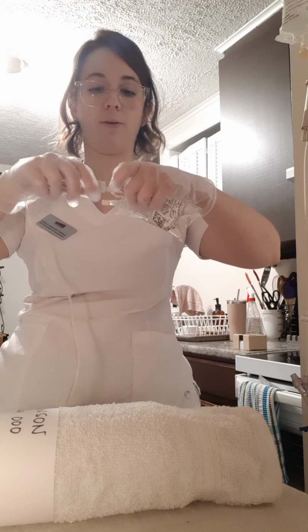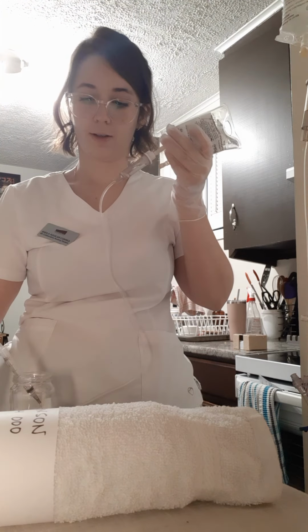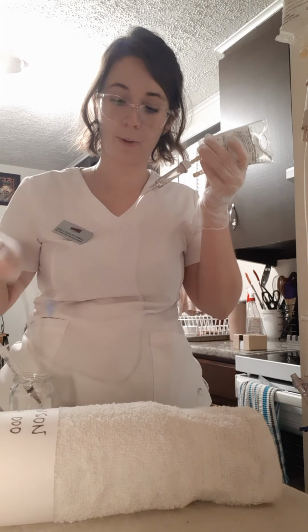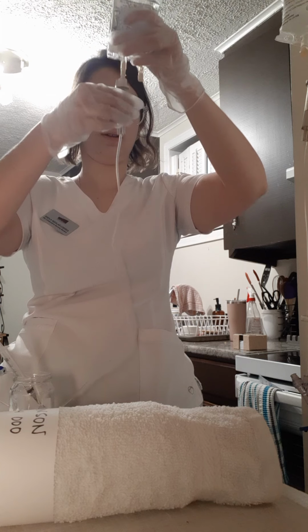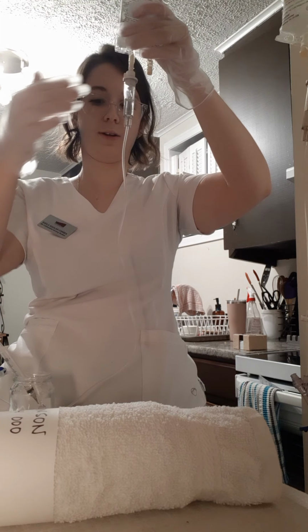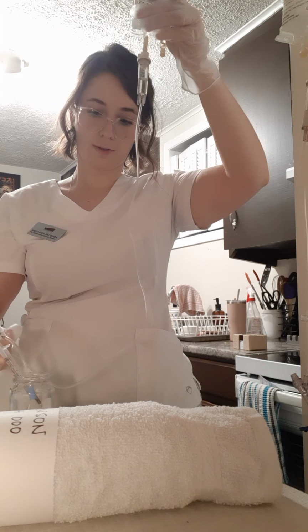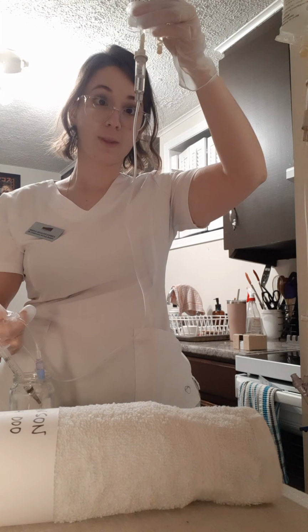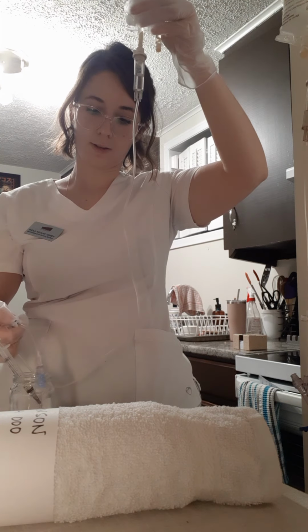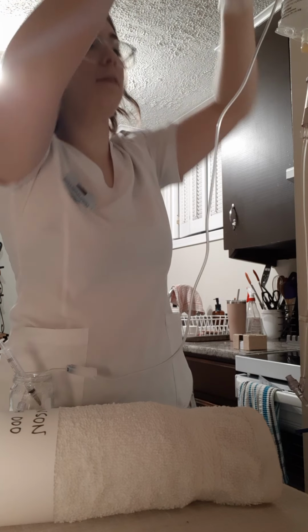Okay, and now I'm going to prime it. I'll put the cap on, doesn't matter. I'm just going to do this really quick. Let some of that water in, and I'm going to open this just to prime it. Perfect. Okay, and I'm going to place my IV bag there.